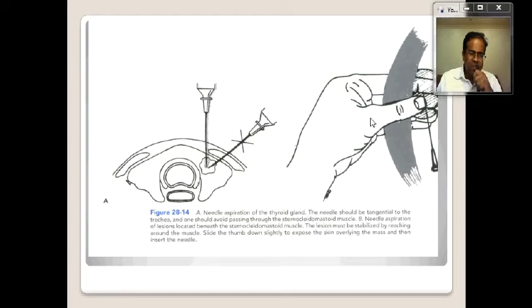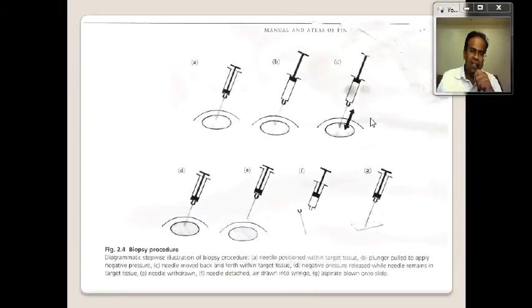So our needles are ready, they are fine needles, our syringe, everything is ready. We have immobilized, we have seen how we can immobilize, how we can enter the lesion. Now coming to the proper technique itself. So this is the sequence of events that happens in an FNAC.